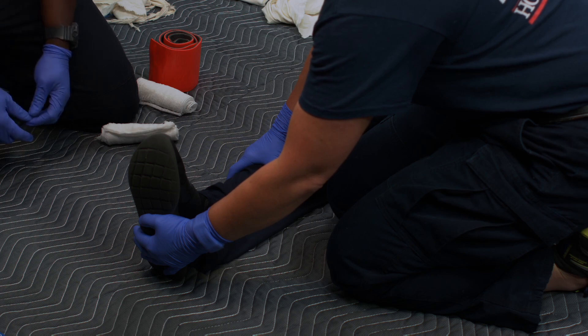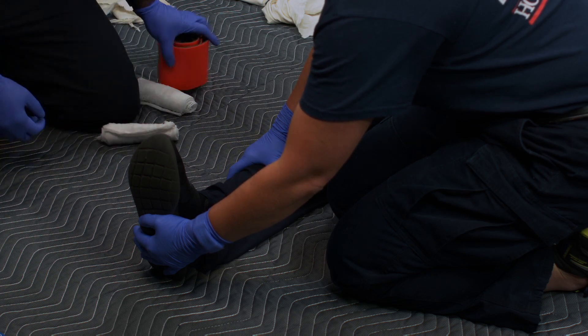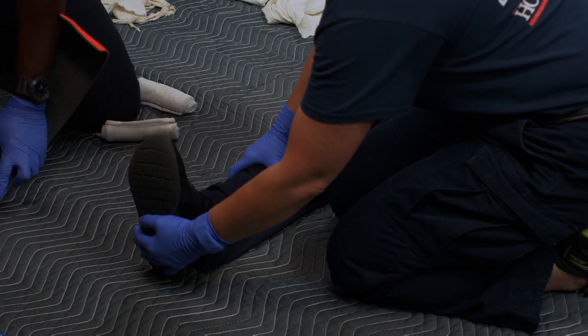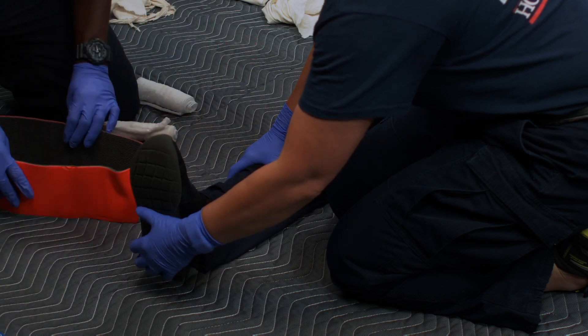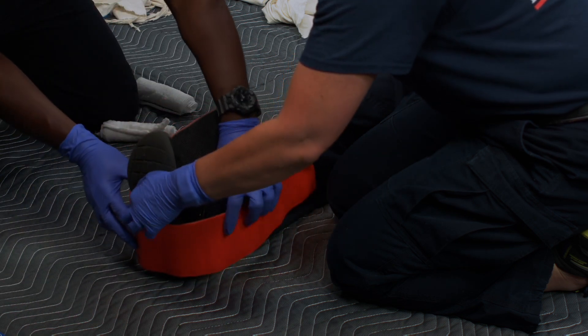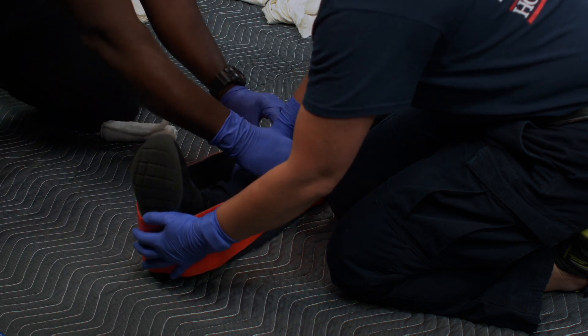If not already done, the injury site will be exposed. The SAM splint will be unrolled. The middle of the SAM splint will go across the bottom of the patient's foot, and the SAM splint should go evenly up both sides of the patient's leg.